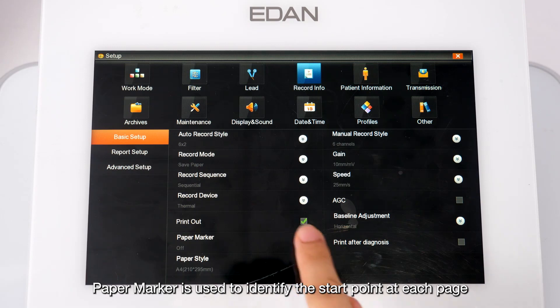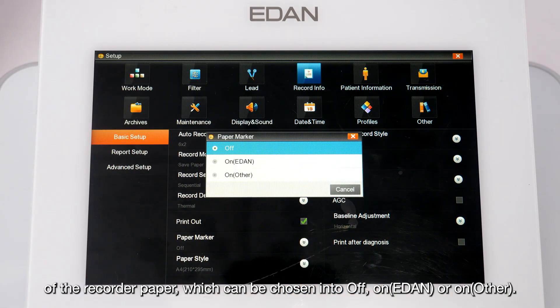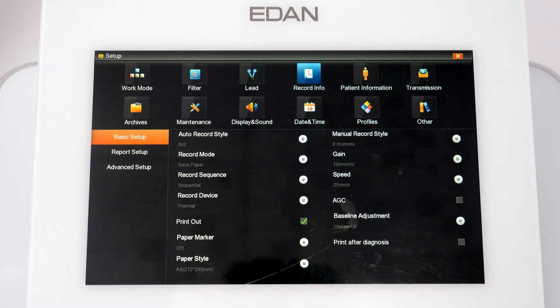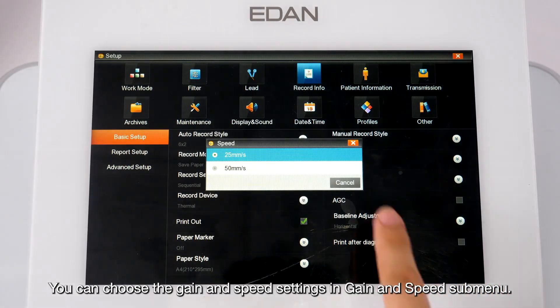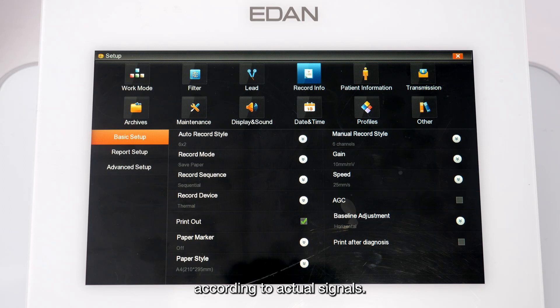Paper Marker identifies the start point on each page of the recorder paper and can be set to Off, On (EDAN), or On Other. You can choose gain and speed settings in the Gain and Speed submenu. When AGC is selected, the gain is automatically adjusted according to actual signals. Click Baseline Adjustment to set the baselines of ECG waves on the printed report.